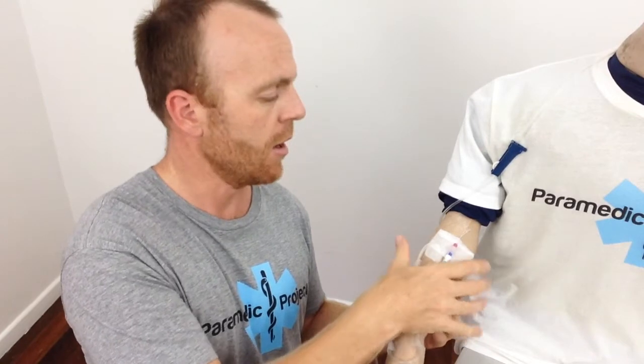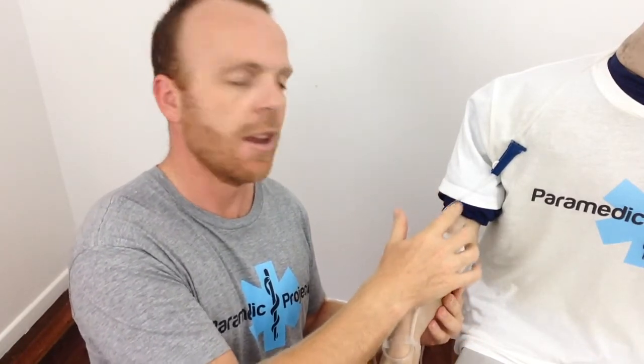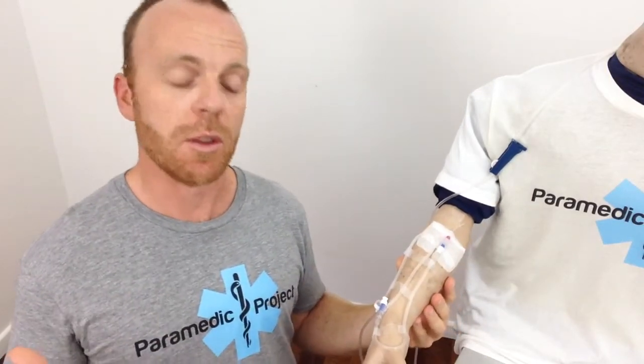Obviously we've got our dressing over the IV site, but I don't like to bandage up over that if at all possible. That just means that I can see if there's any bleeding at that site or if there's any extravasation of IV fluids underneath the skin. So that's another really important point.